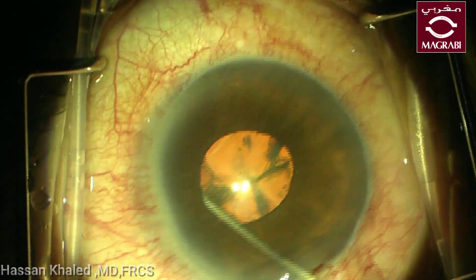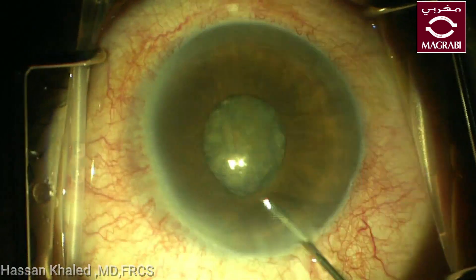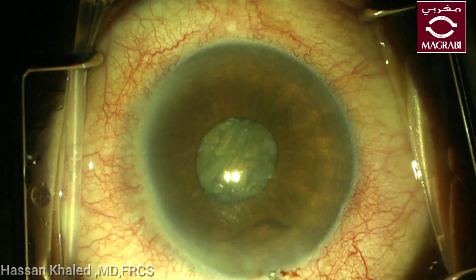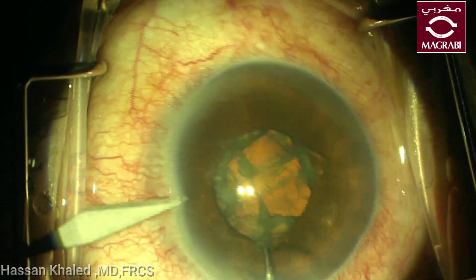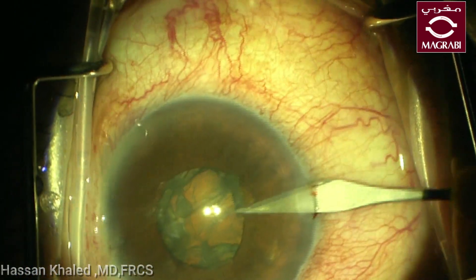Complete hydrodissection in this case is important while doing phacoemulsification through the narrow pupil, so you will be sure that the nucleus is freely rotated, which can facilitate the chopping of this cataract through this small pupil.